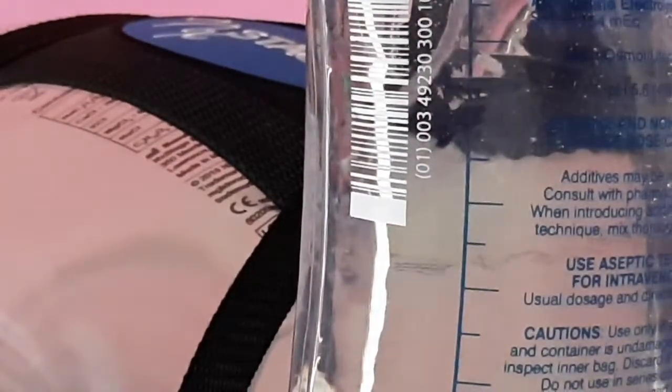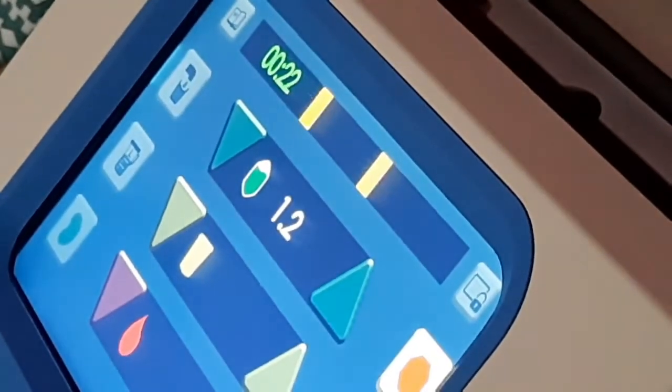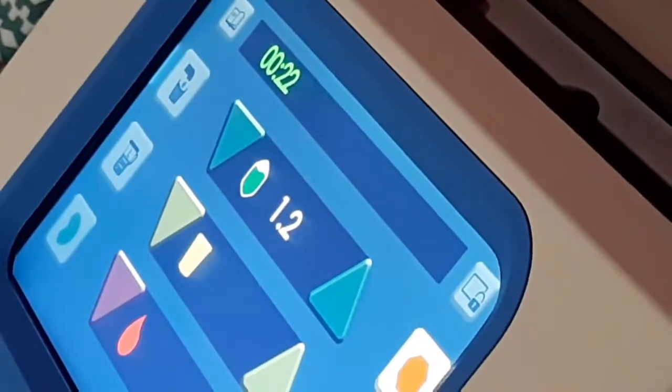So as it does that, this is my cue. Like I said, it has 23 minutes. It's a countdown. This is my cue to go ahead and prep. And I'll show you what that prep is.